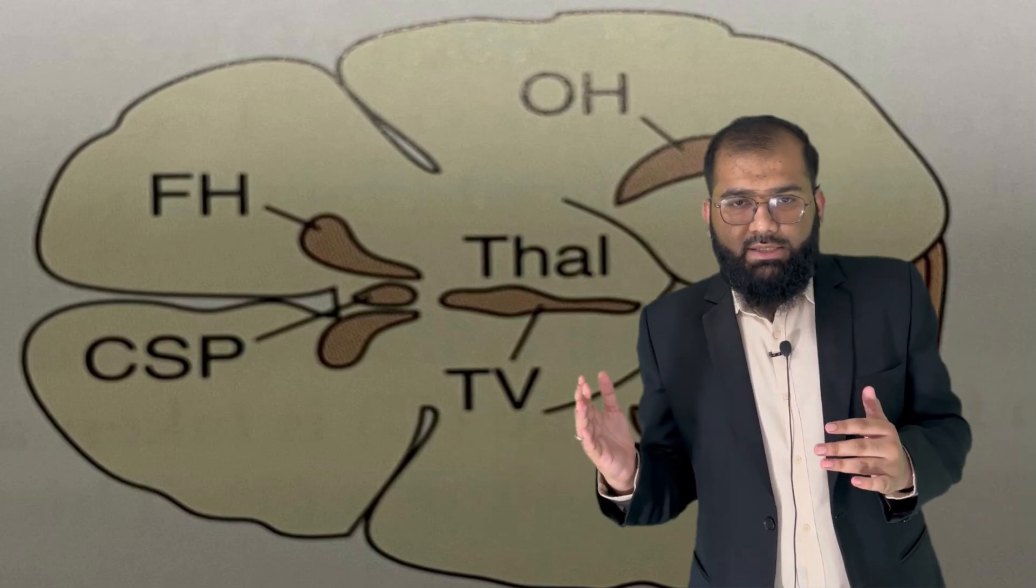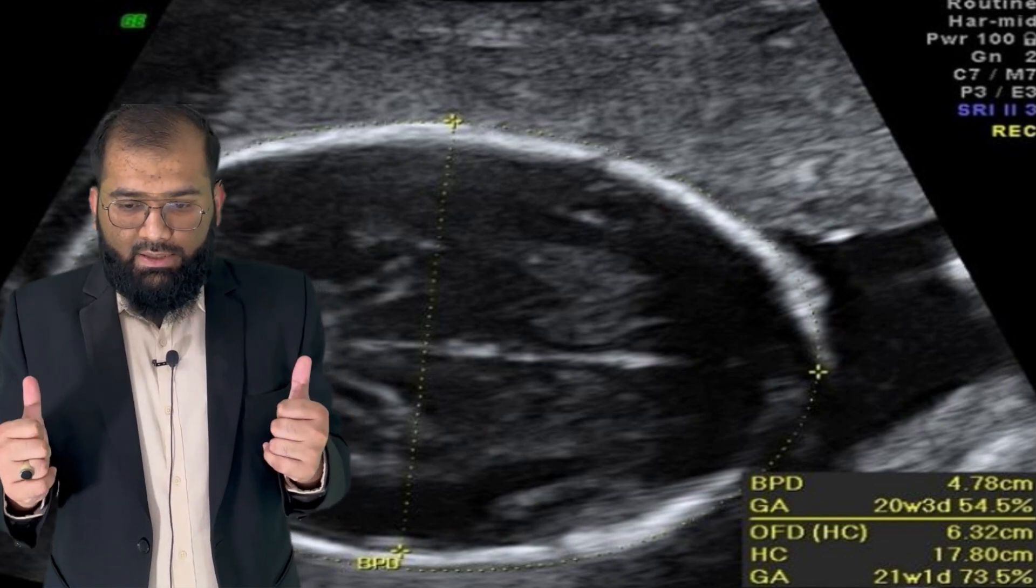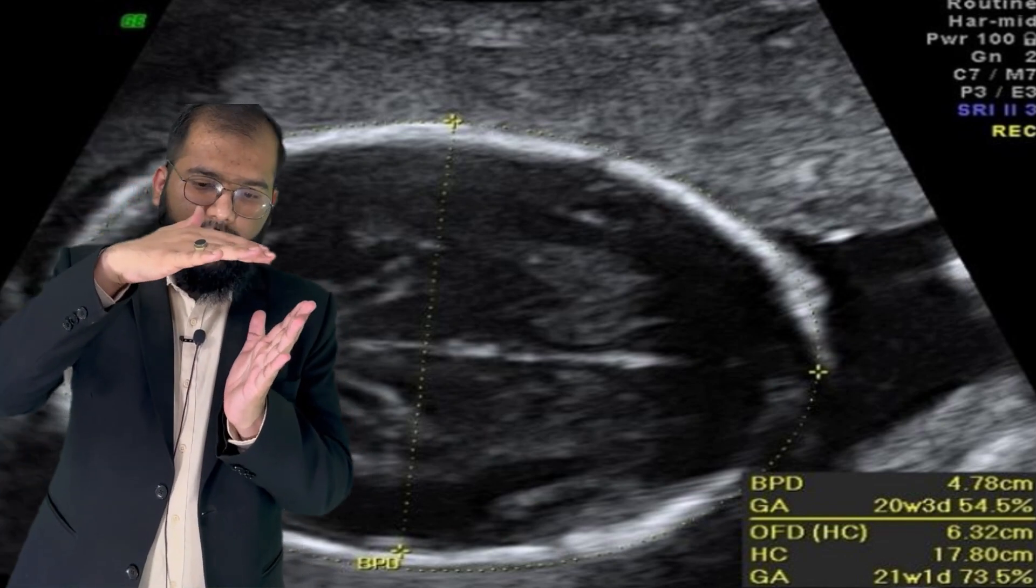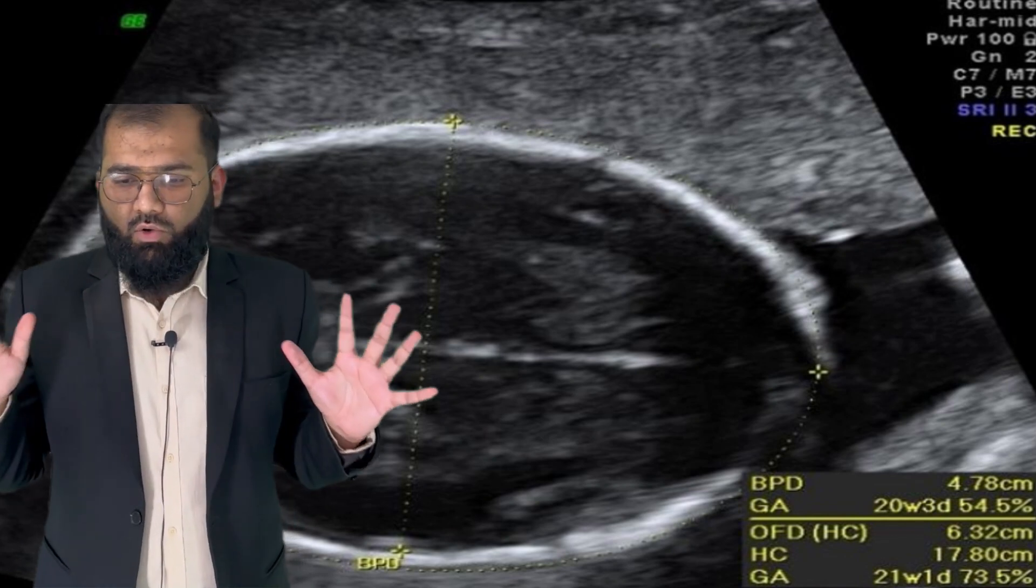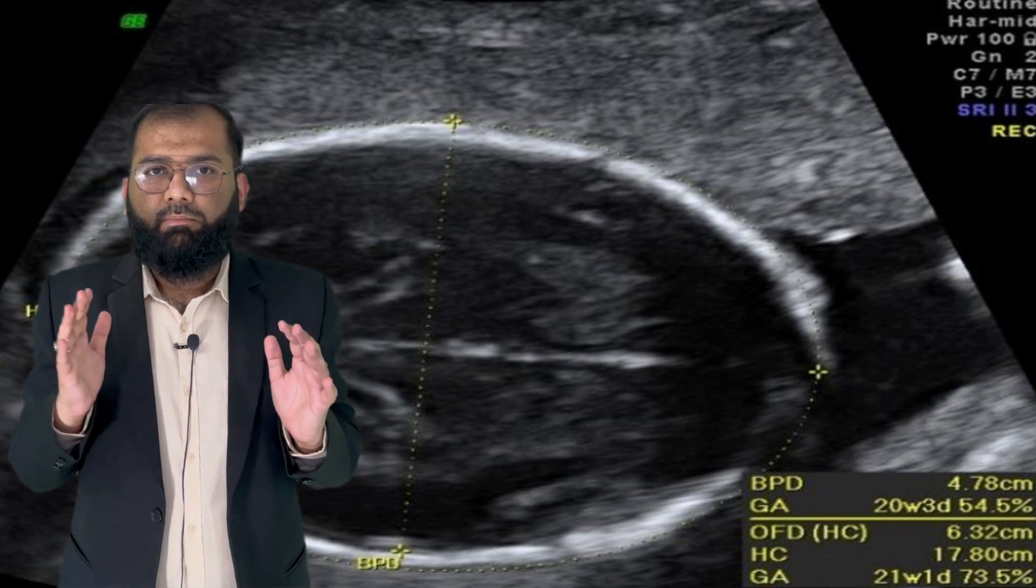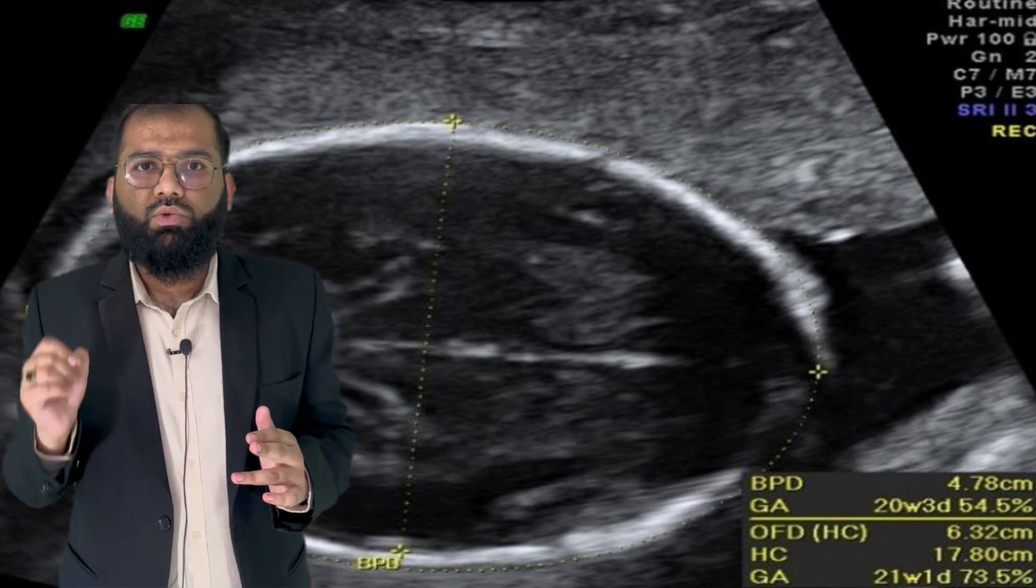Now we see the next image. In this image we are able to see the two thalami making a posterior arrow, and you are not able to see any cerebellar lobe. We take BPD, that is biparietal diameter, from the outer end to the inner edge.